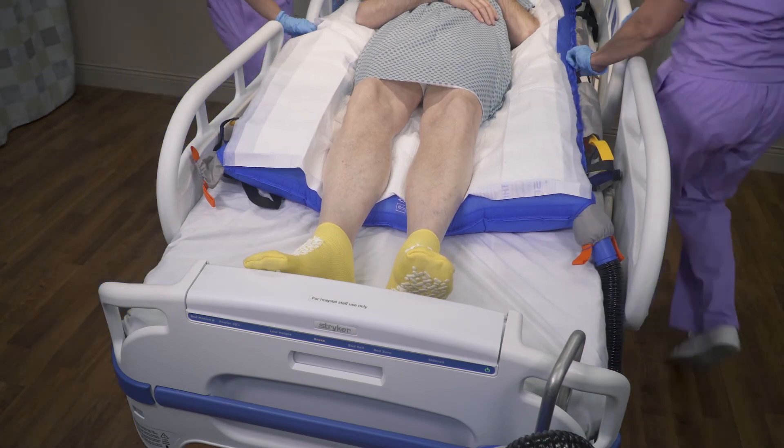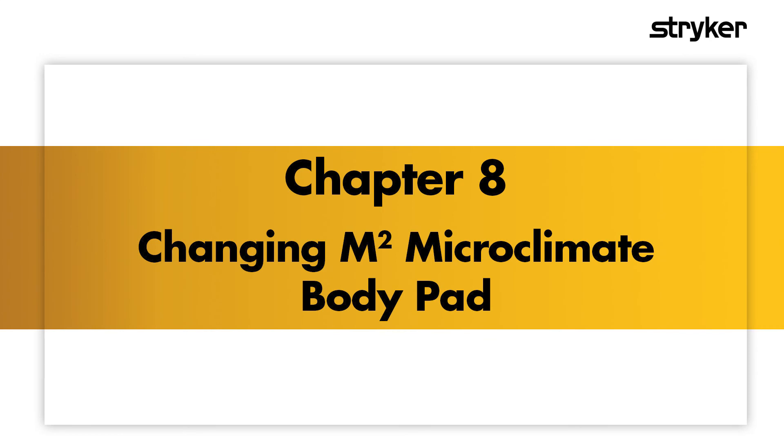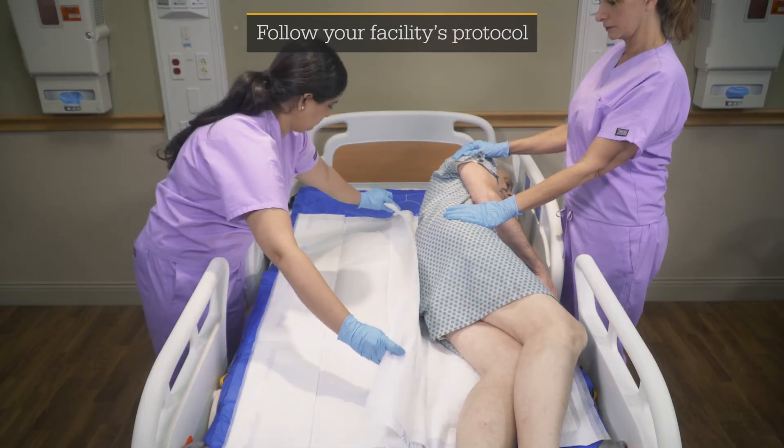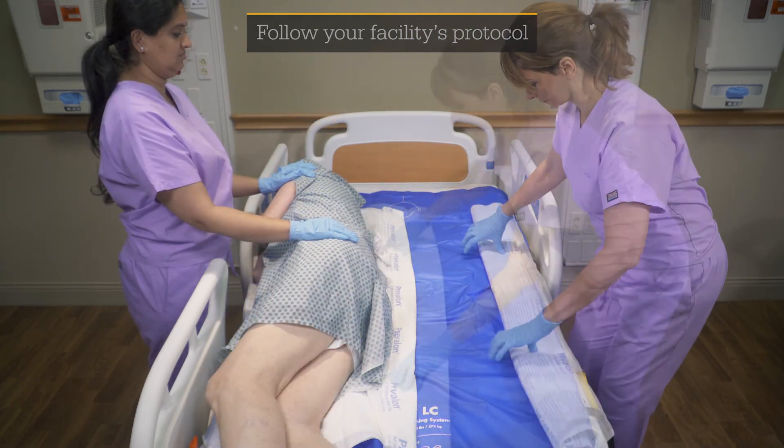Smooth out any wrinkles. If the microclimate body pad becomes soiled, remove it and replace it with a new one.